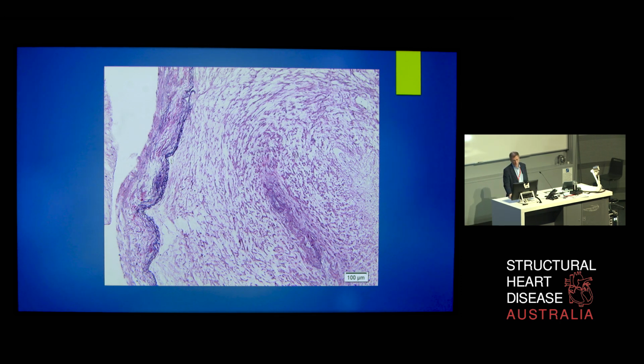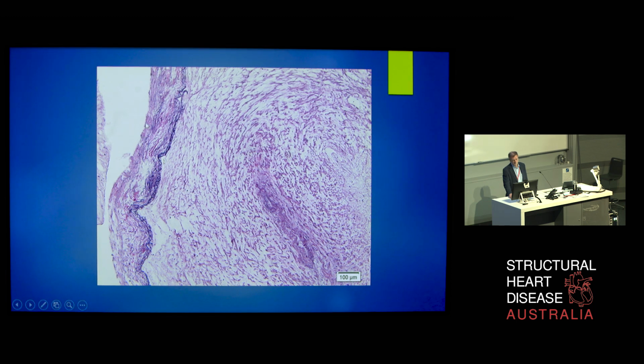So this is thromboembolic disease. Now you might think, and logically so, that the plane of dissection is at the intimal level. Well, it's not. There's the intima there. The internal elastic lamina is there, and it's very fragmented because all this is very abnormal. The plane is there. It's about a third of the way into the pulmonary artery. So you can see, if you're out here, then it's going to be a most inadequate endarterectomy. If you're out there, then you're just a hairbreadth away from perforating the pulmonary artery. So you've got to know exactly where you are.